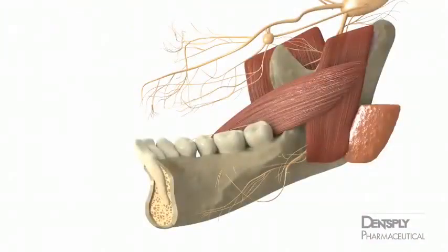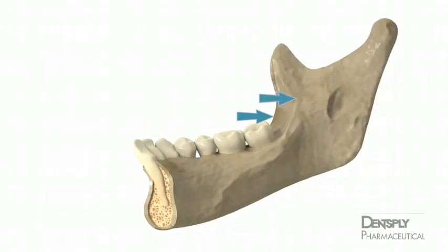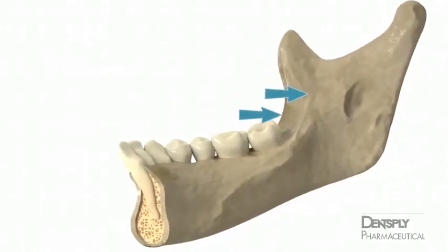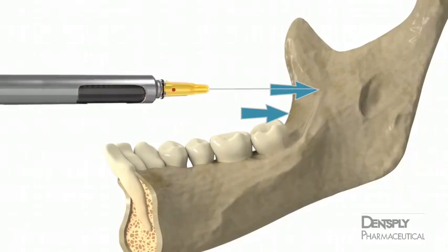These errors are more likely to occur in the patient who is missing posterior teeth. The prognathic mandible represents a special challenge because in this case, the greatest concavity of the coronoid notch is not predictive of the mandibular sulcus, which lies some distance superiorly. Therefore, in patients with class 3 malocclusion, the insertion point should be made 1 centimeter above the line bisecting the thumbnail.